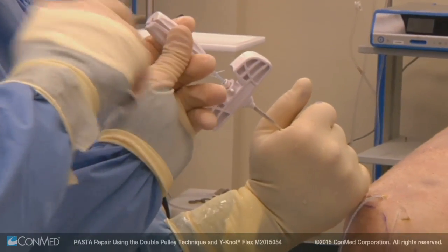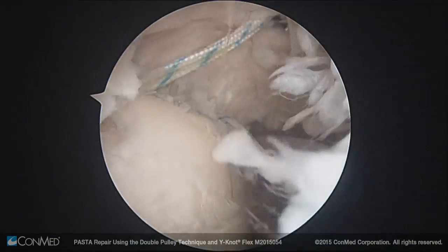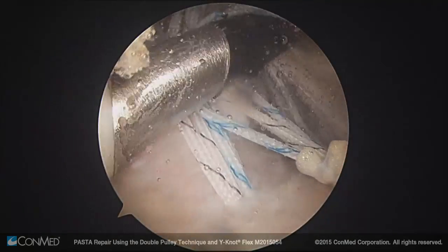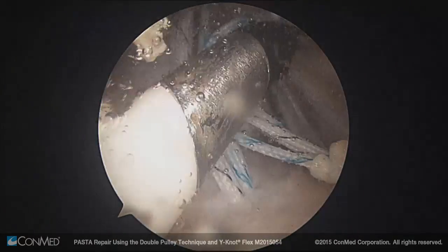This process is repeated for insertion of the second anchor. Before tying, I'll use the edge ablation system to get better visualization of the subacromial space and suture.